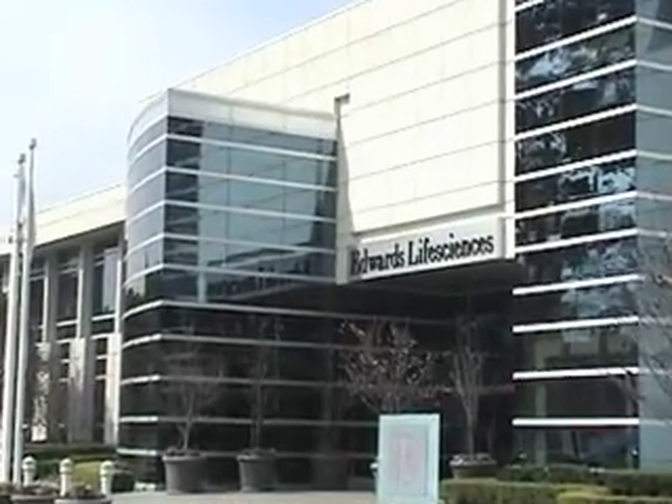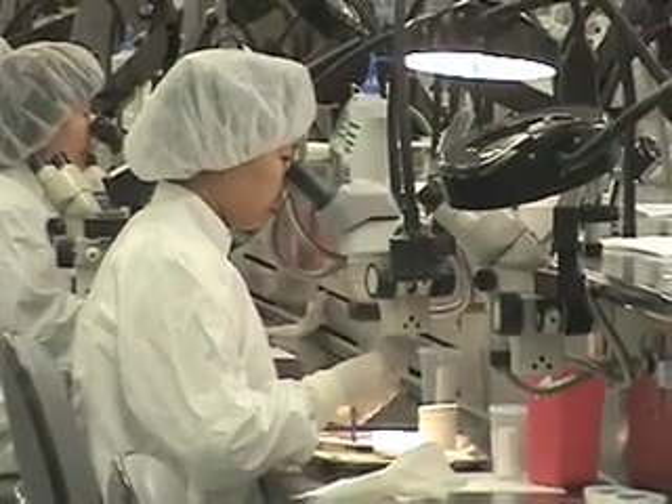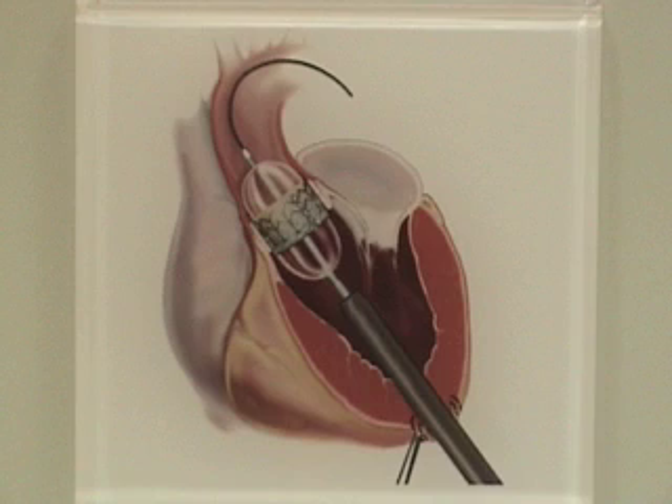This is Colin Stewart, Innovation Writer of the Orange County Register, taking you inside Edwards Life Sciences of Irvine, which has developed two techniques for replacing failing heart valves without major surgery.